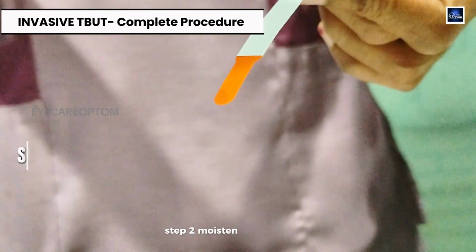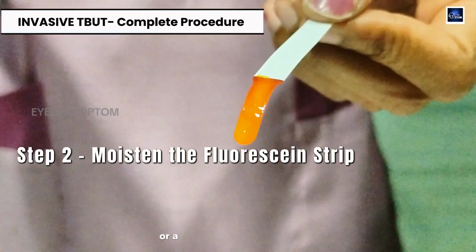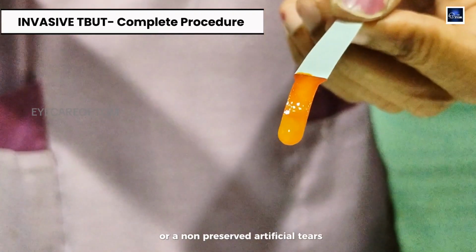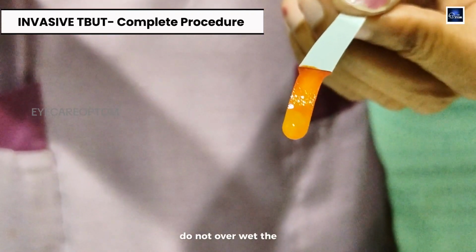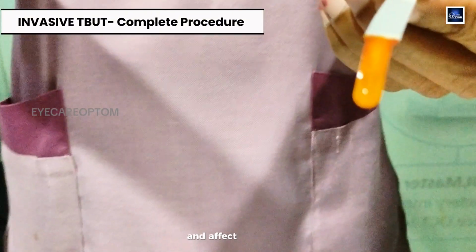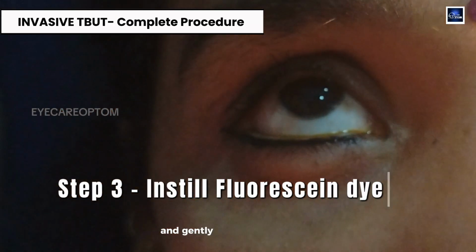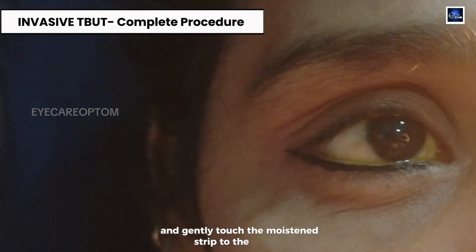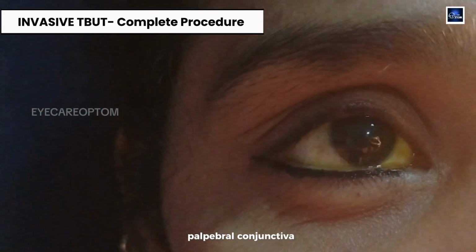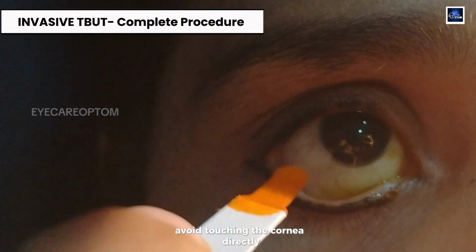Step 2. Moisten the fluorescein strip with a single drop of sterile saline or non-preserved artificial tears. Do not overwet the strip, as too much fluorescein can dilute the tear film and affect the results. Step 3. Ask the patient to look up and gently touch the moistened strip to the inferior palpebral conjunctiva, the inner surface of the lower lid. Avoid touching the cornea directly.